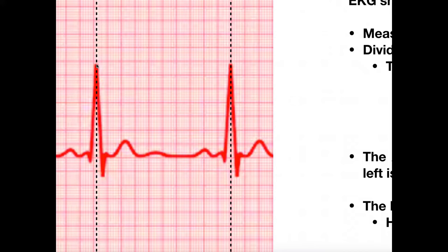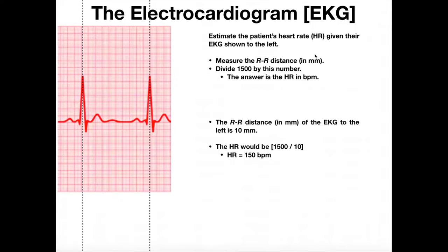I start here and count: 1, 2, 3, 4, 5, 6, 7, 8, 9, 10. Technically, because this is a little over to the right of the start of this red line, it would be a little bit less than 10, but we're just going to estimate it as 10 millimeters.